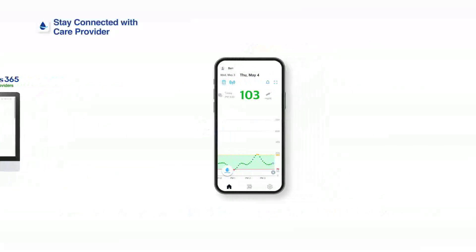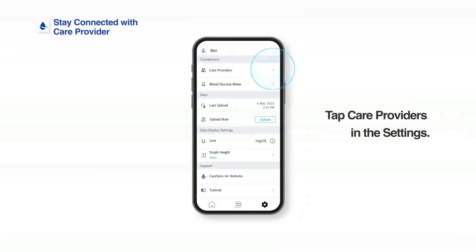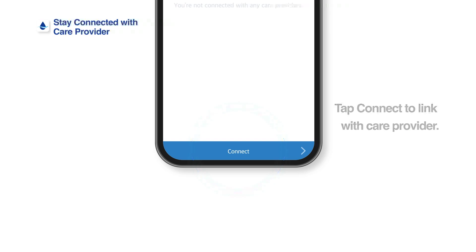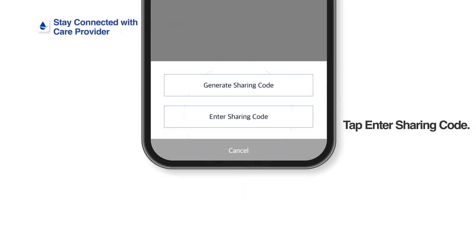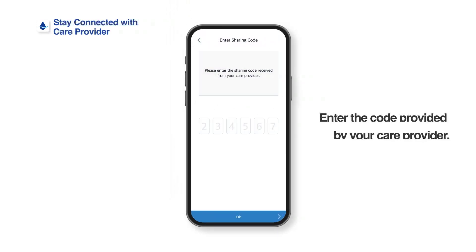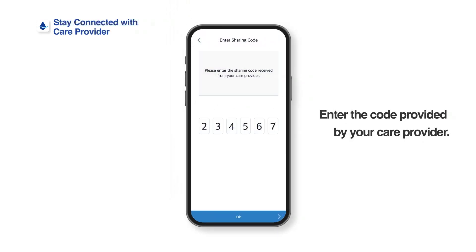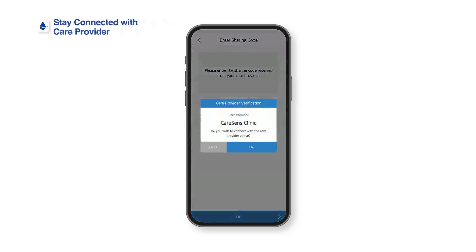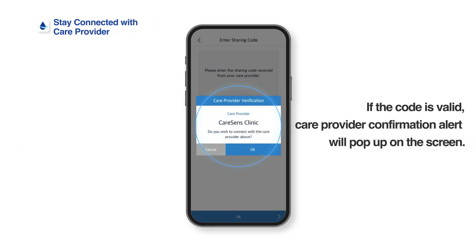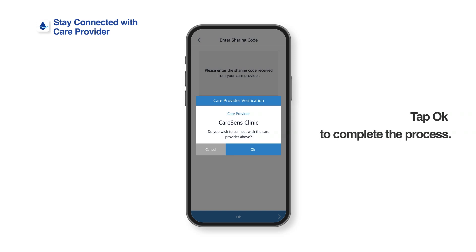Users can also enter the code provided by care providers to connect with them. Tap Care Providers in Settings, then tap Connect, then tap Enter Sharing Code. Enter the code provided by your care provider. If the code is valid, a care provider confirmation alert will pop up on the screen. Please make sure you are adding the right care provider. When the process is completed, a completion notification will be shown.